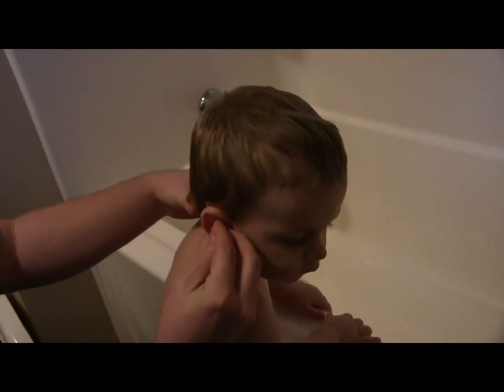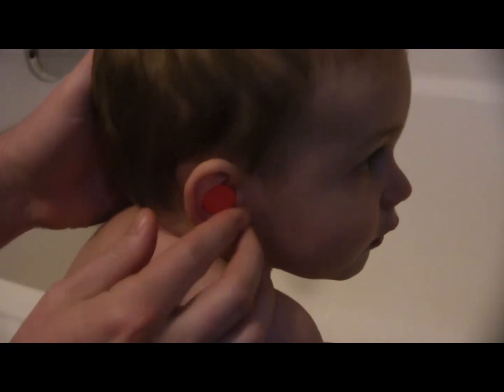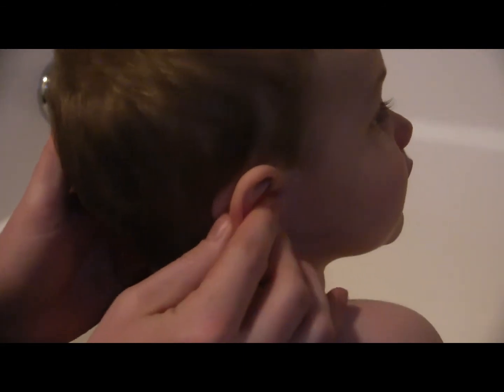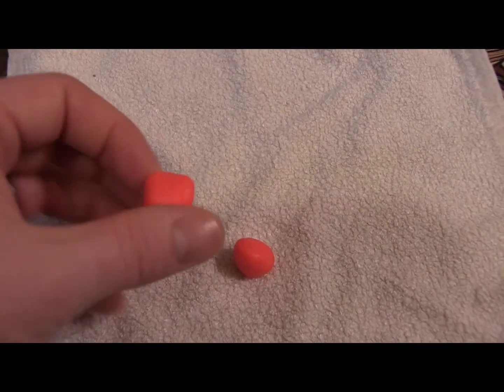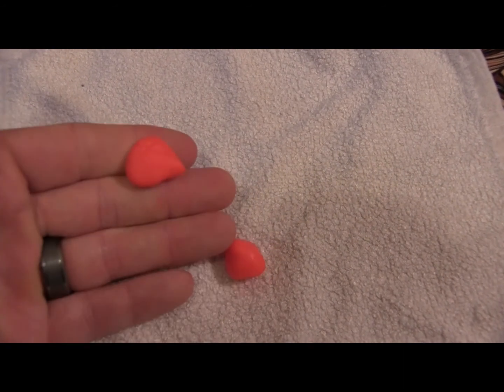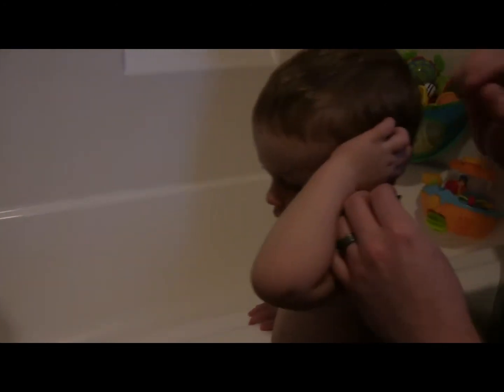The putty style earplugs go in to the ear but not actually into the canal. They form inside the pinna. Sometimes these ones work a little bit better if you pre-mold them to fit the patient's ear before you try putting them in. So this is a plastic earplug that is pre-fitted for the patient's ear.